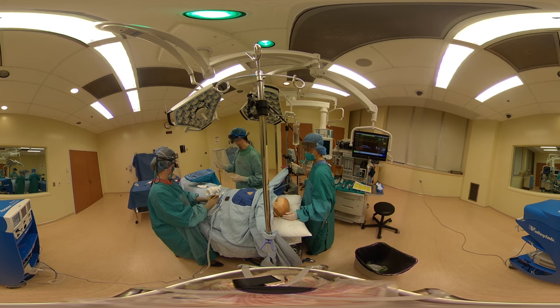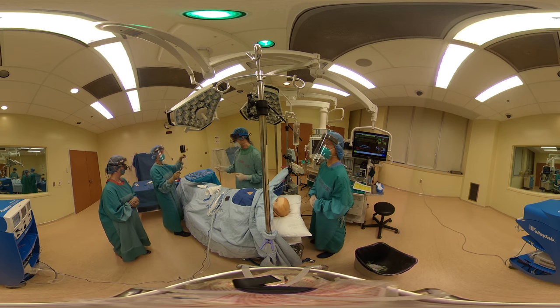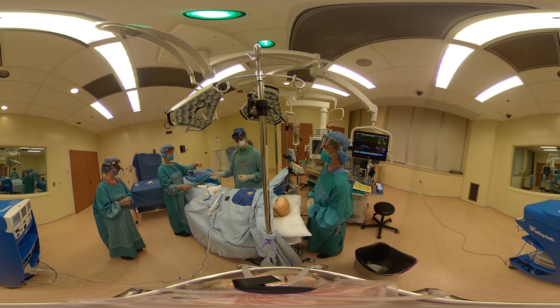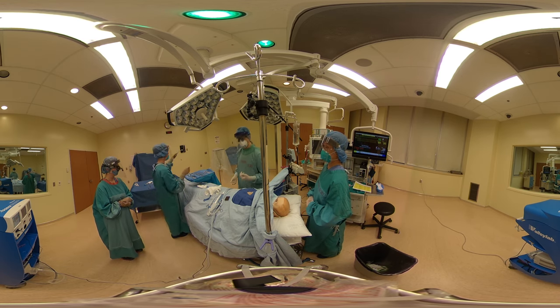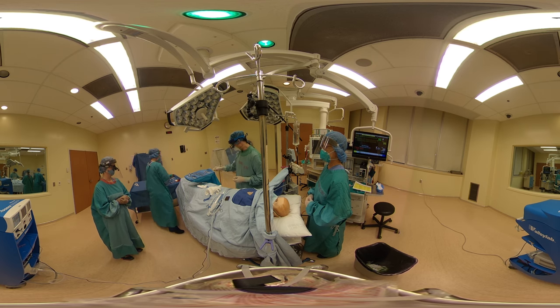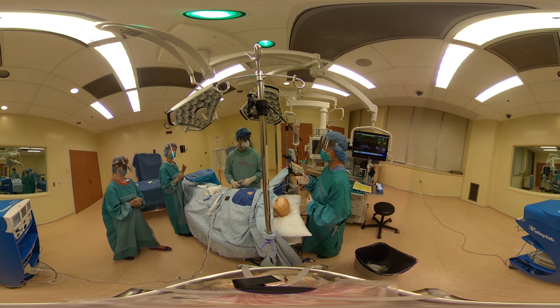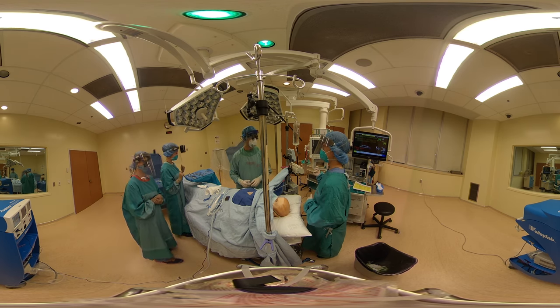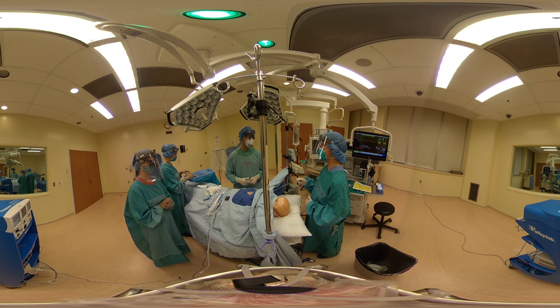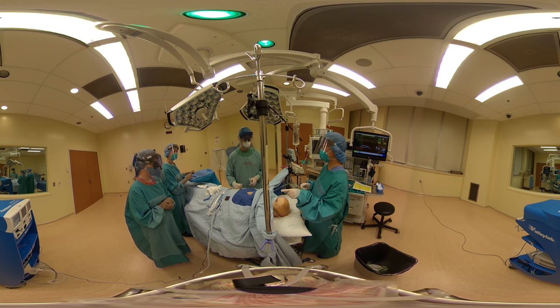We have some backup airway adjunctive measures here. We have an endotracheal tube with a stylet and a bougie as well, should we proceed with the paralyzed technique. If the patient's saturations are going down too low and it's taking too long to put the tracheotomy tube in, our backup plan is going to be the bougie and the endotracheal tube.